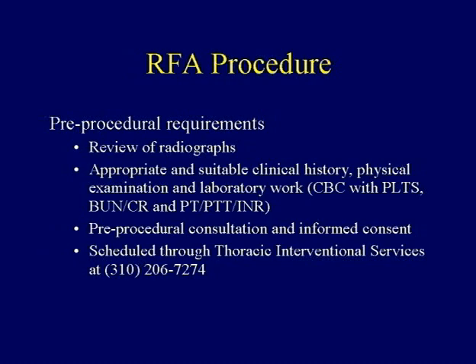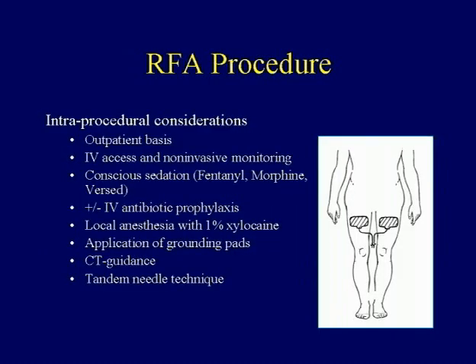You have to make sure that there's a good clinical history, that you've gone through your characteristic pre-workup, as you would do for any interventional procedure. And we have a scheduling service that we market every time we show it. We also have some intra-procedural considerations. We try and do these things on an outpatient basis. If this is to have a place in the management, we feel it should be outpatient-based.